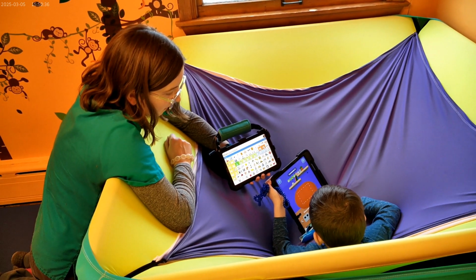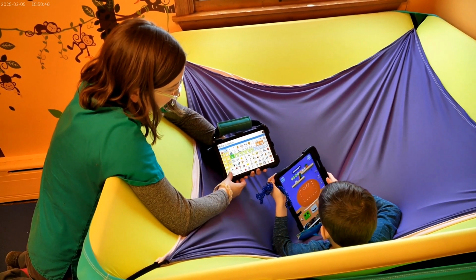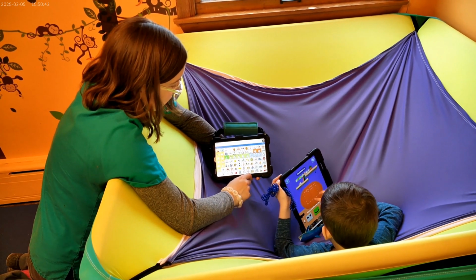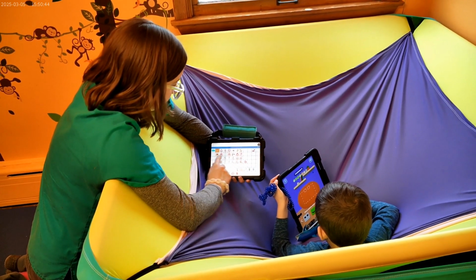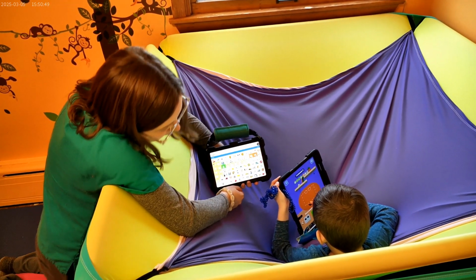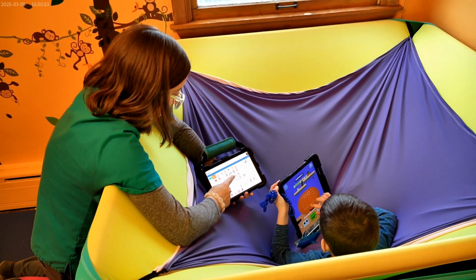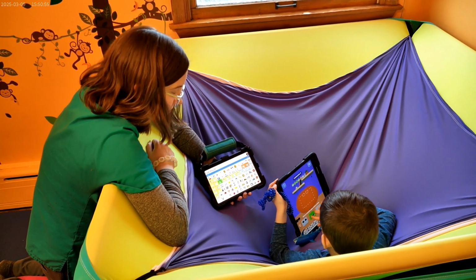As you can see here, I'm with a child who is an AAC user. He is playing a game on a tablet, and I'm modeling on an AAC device for him. While I have the AAC device in his reach as much as possible so that he can use it if he chooses to, I'm not making him use it. Rather, I'm modeling words that go along with what he is doing on the game, showing him the language that can be used.